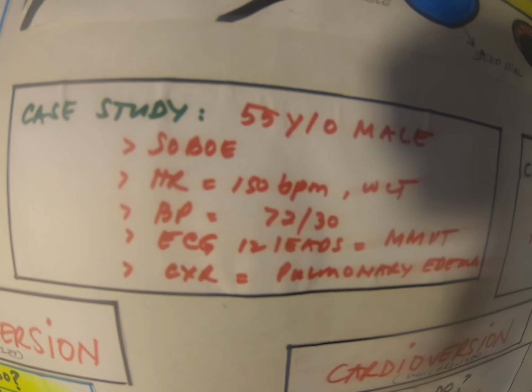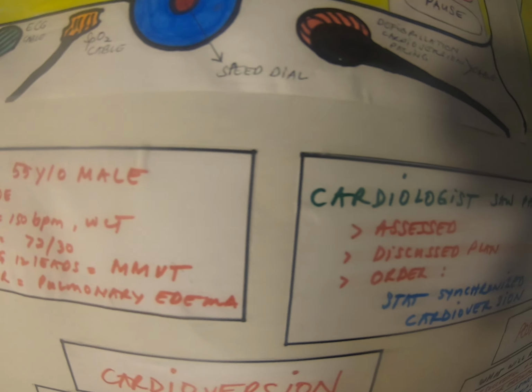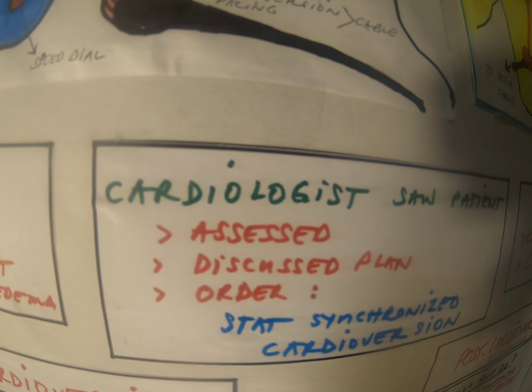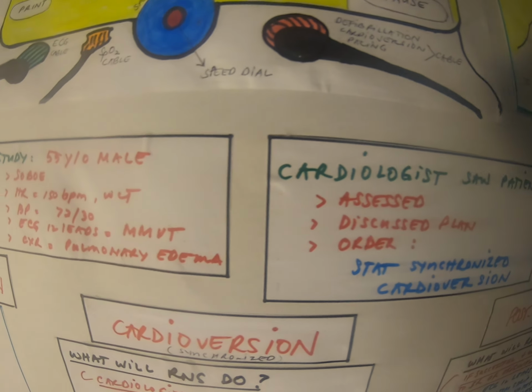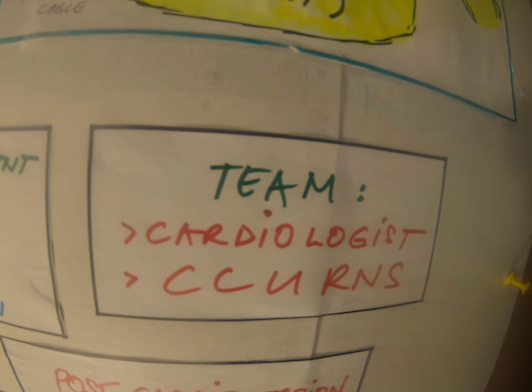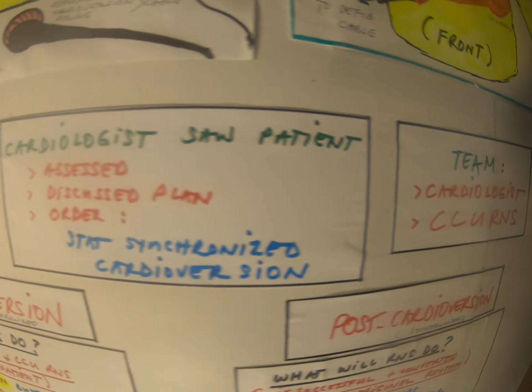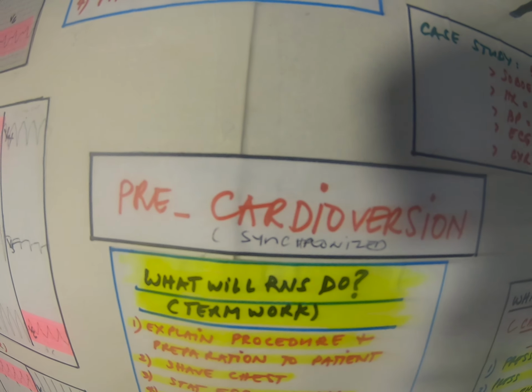Chest x-ray revealed evolving or starting pulmonary edema. The cardiologists have seen the patient, talked to the patient, assessed, discussed the plan, and ordered a stat synchronized cardioversion. Our team involves the cardiologists and the CCU RNs. So here we go, the pre-cardioversion for a synchronized cardioversion.